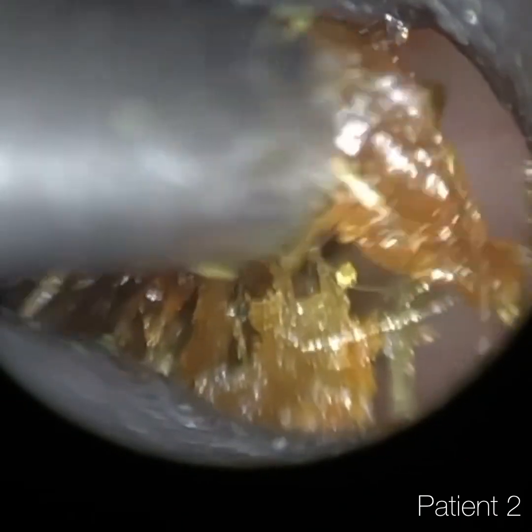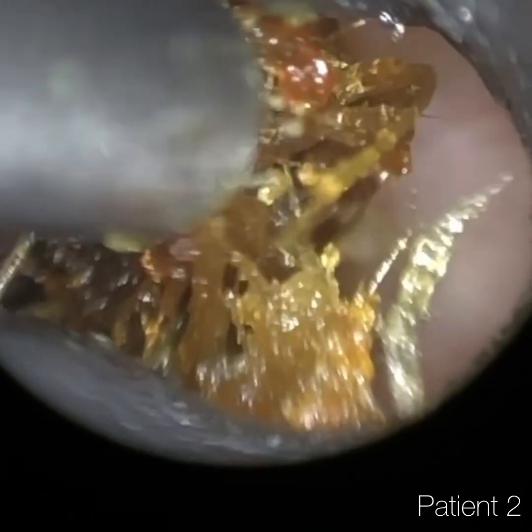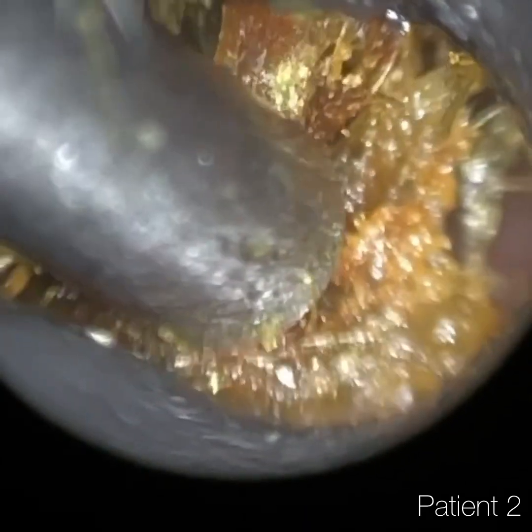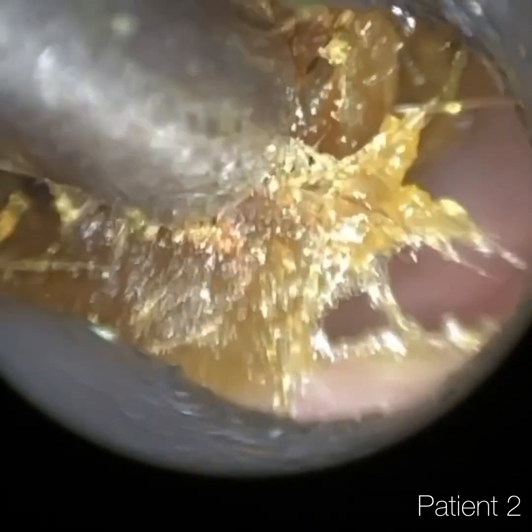So I just advise the patient to position some cotton wool — not to push it in the ear, but just to seal the entrance while they're trimming their ear hairs. And that should help.